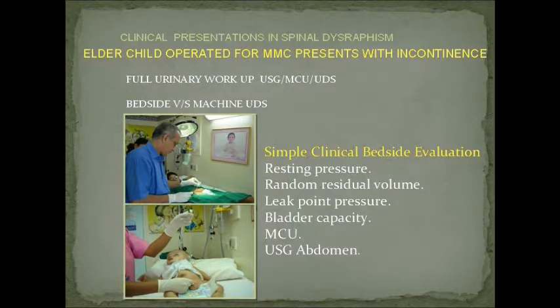And we did a clinical bedside evaluation separately of these 25 patients, and it was a double-blind study which was then compared at the end of 25 studies where both were done. We opened the envelopes in front of 3 observers, and there was only one mismatch in the conclusions. So interpretation is not to be underemphasized. I mean, it's very important.